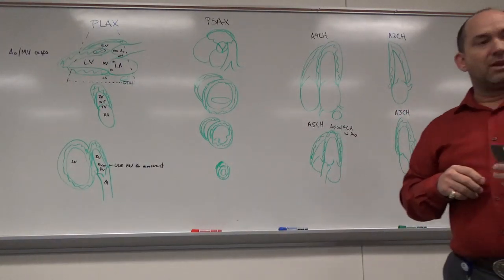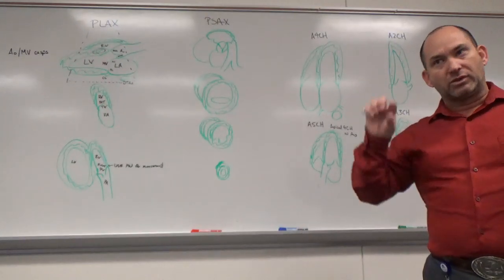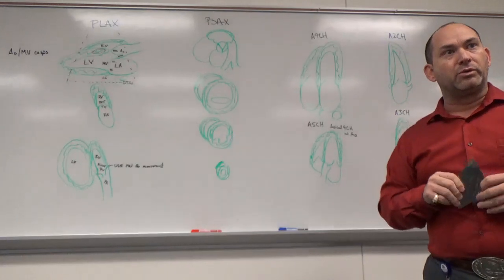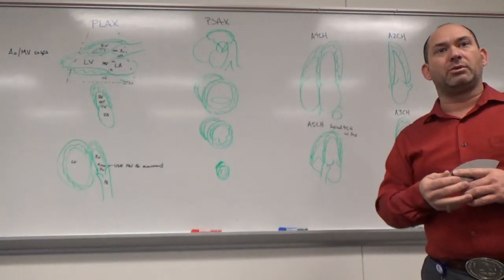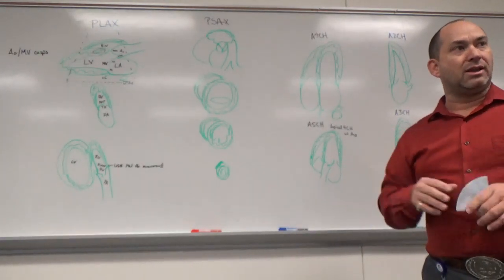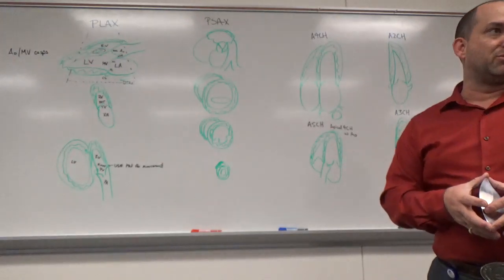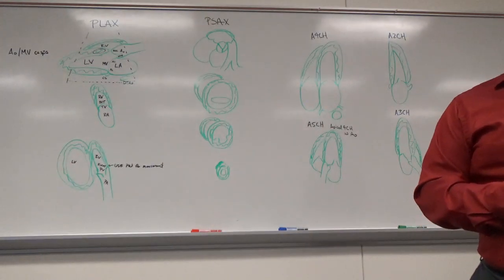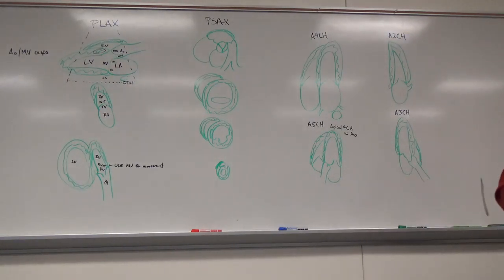Okay, it says in the textbook that looking at a gallbladder alone, so it's just one little fluid-filled structure, it should take 6 minutes to have properly evaluated a gallbladder. That's one little structure. I've seen people do entire cases of an abdomen in 6 minutes and just give me garbage images, and then they're like, oh, it was just a tough patient. No, it wasn't just a tough patient, you didn't try. Okay? You can tell those things just by the image. I digress. Let's go back to labeling.